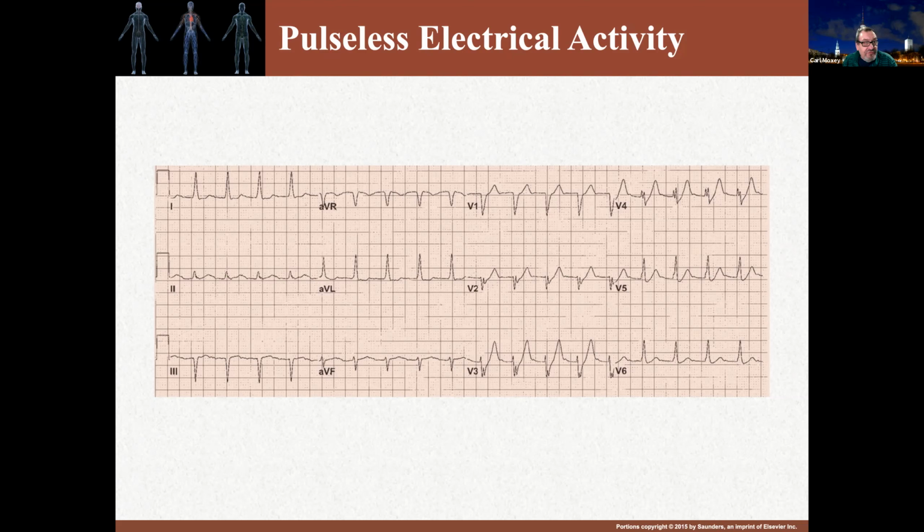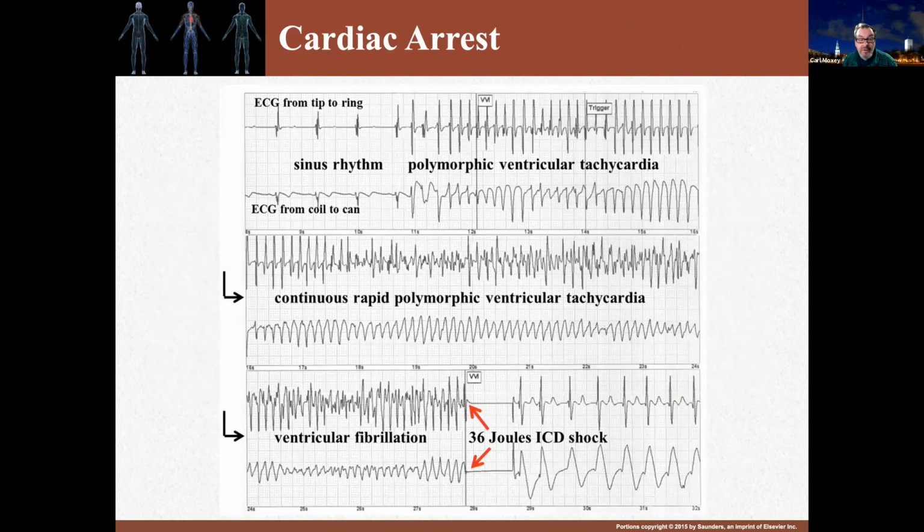Now, if you take a look at the EKG tracing, you would note that despite the presence of electrical activity, everything from the rate, the rhythm, the P waves, the PR interval, QRS complex reflect only the underlying rhythm. In other words, you can't tell looking at this EKG that you in fact have pulseless electrical activity. So if you have another monitor like a pressure monitor and it tells you there is nothing going on, that's what you should pay attention to.